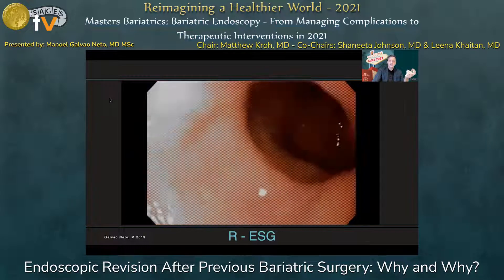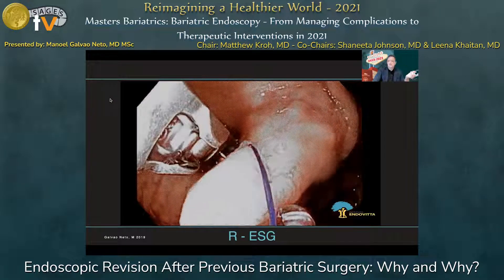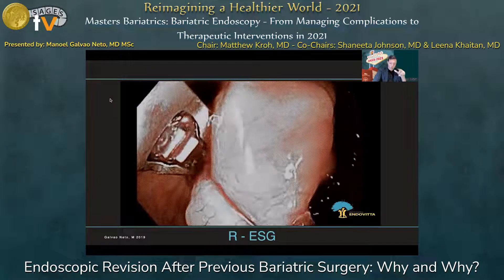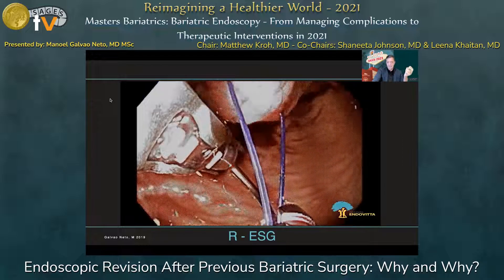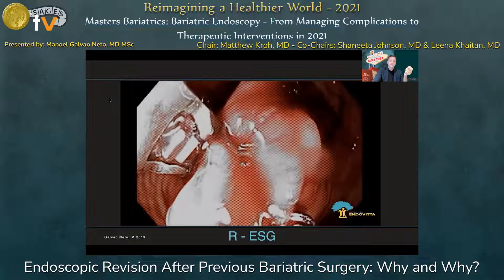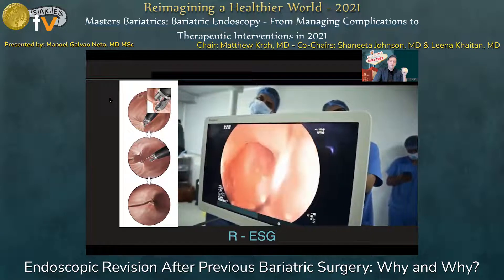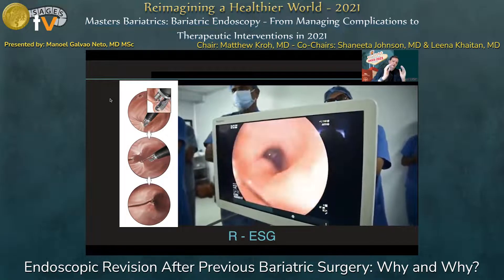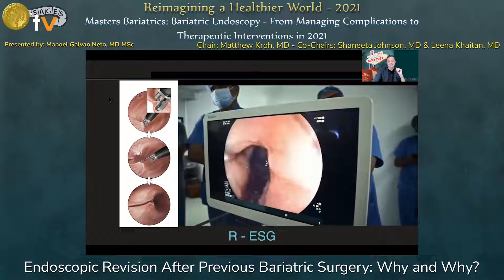The tube gets bigger and patients can regain weight, as you can see in a case seven years after the procedure. The way we address this is very similar to endoscopic sleeve gastroplasty — using a U-shape or triangular suture pattern. You can clearly see how much we can reduce the sleeve — just compare the pre-procedure endoscopy with what we achieve after the revision procedure, where we significantly narrow the tube.